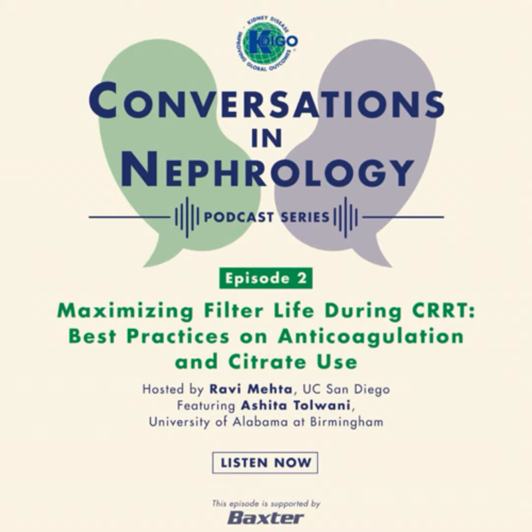That is correct. It's been very challenging. There are patient-related factors and technique factors that make this so challenging. The patient-related factors, of course, are that these patients often are hypercoagulable, and this can be from the cytokine storm or other reasons. During this time, we also wanted to limit nursing exposure and use of PPEs. So that related to issues with maintaining CRRT circuit patency also.